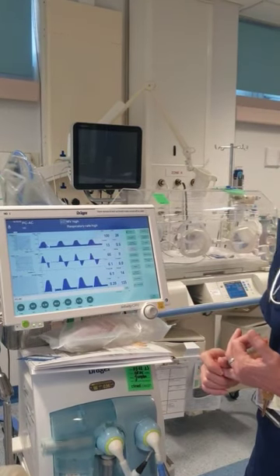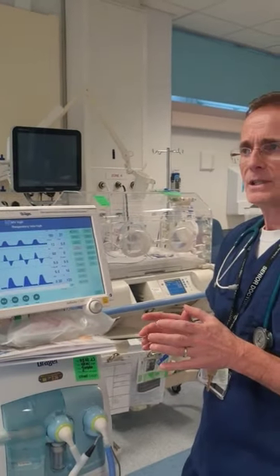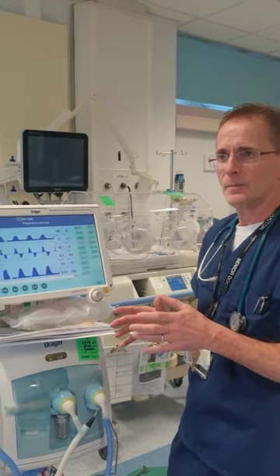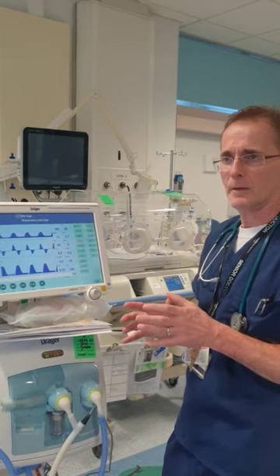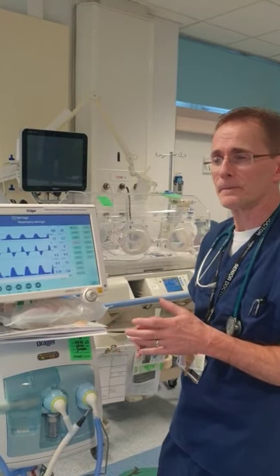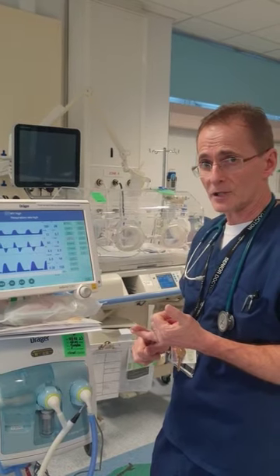A couple of things to note. In small babies, we tend to opt for frequencies, or hertz, in oscillation of about 15 hertz. In large babies, we tend to opt for a slower oscillatory frequency of, say, maybe 10 hertz. So that's the frequency of oscillation.